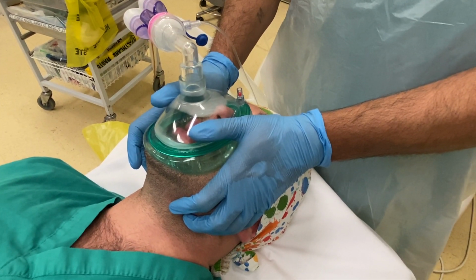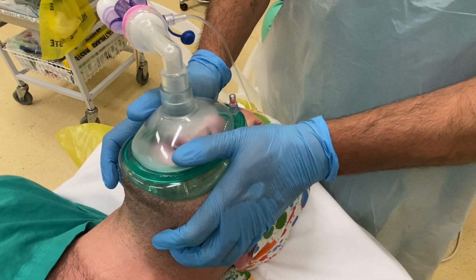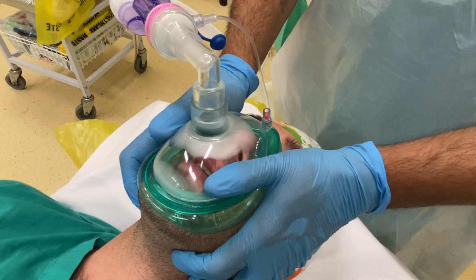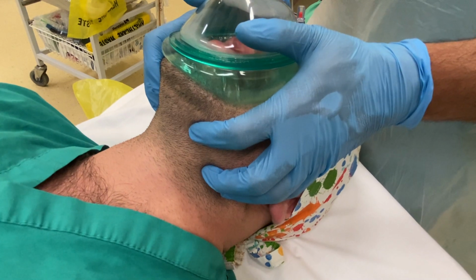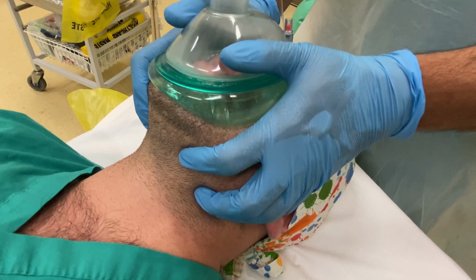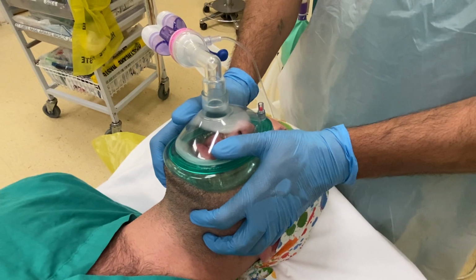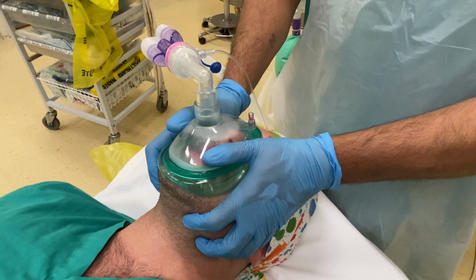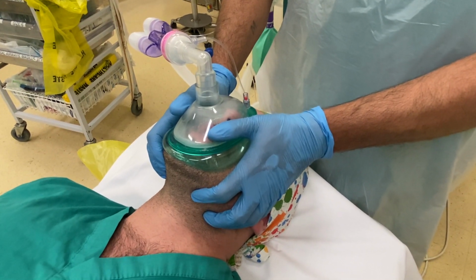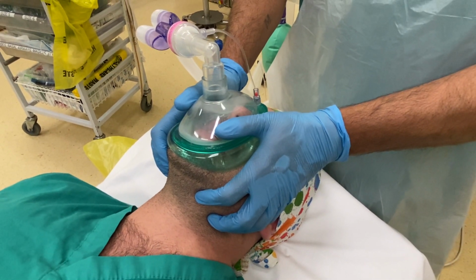This is the way that you can do it if you're struggling, and particularly if you're not used to holding a face mask. So using your thumbs and the heel of your hand up on the mask, you use the thumbs and the heel of the hand to press down, and you use all the other fingers in your hand to pull the jaw up from the angle of the jaw and all along the edge of the mandible up into the mask. So that's 4 different ways to hold a face mask. Gently holding it at the top, the C grip, and then when they're asleep we have the full CE, and then we have the thumb and heel of the hand pressing down. So that's 4 different options to hold a face mask.